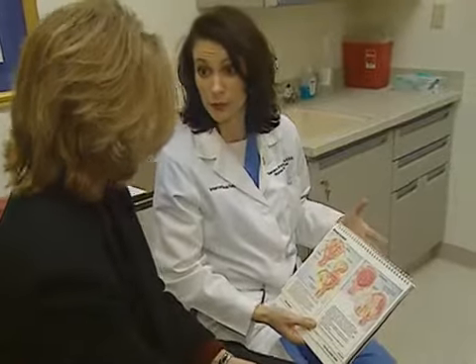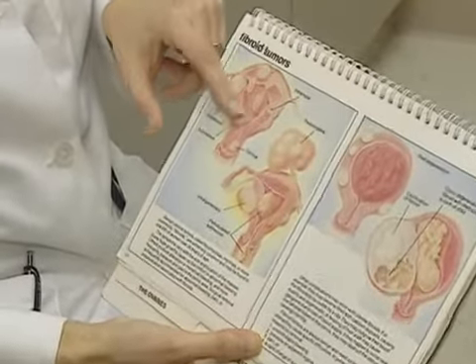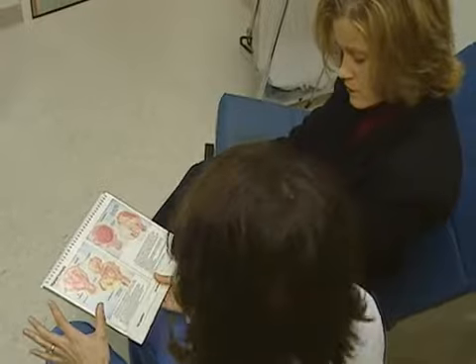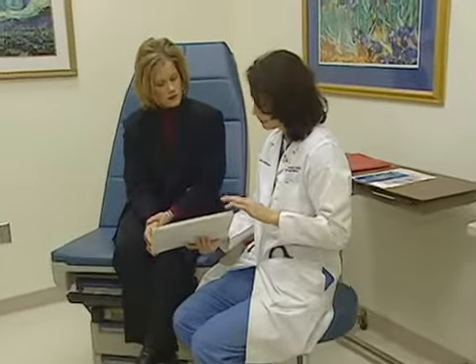Uterine fibroids are common benign tumors that grow from the muscular wall of the uterus. Fibroids may cause heavy bleeding, pelvic discomfort, pelvic disfigurement, anemia, and create pressure on other organs. Currently, the most common treatment for fibroids is a hysterectomy.